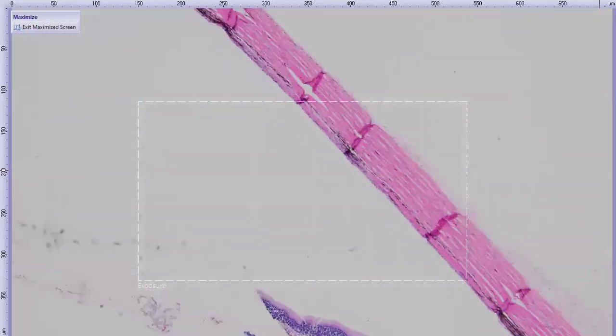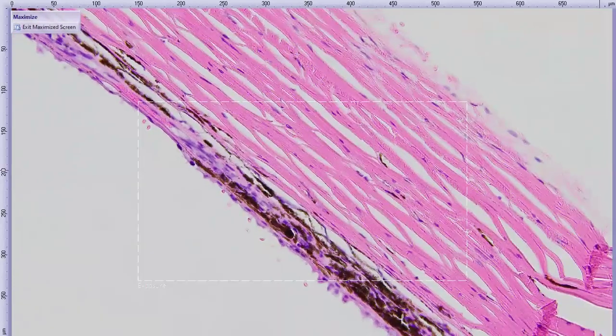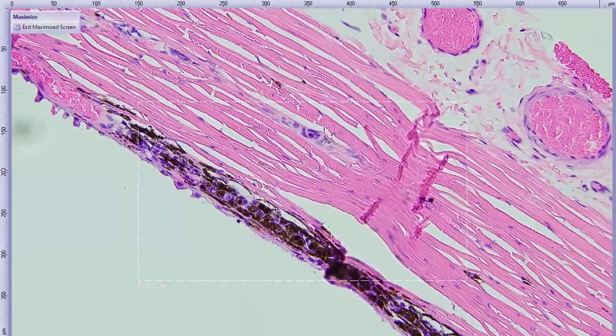I'm going to come out more to mid-fundus or so here and find the fields that I want. Nope, that's definitely not what I wanted. Wait for it. Maybe here is okay. So we already were seeing it while I was touring you around the eye, but there's definitely lymphocytes and plasma cells in the choroid stroma as well.